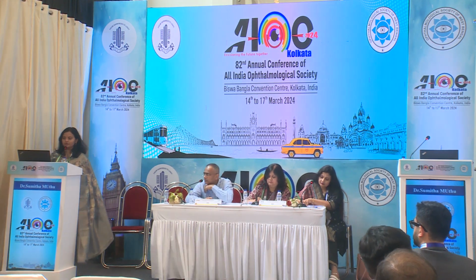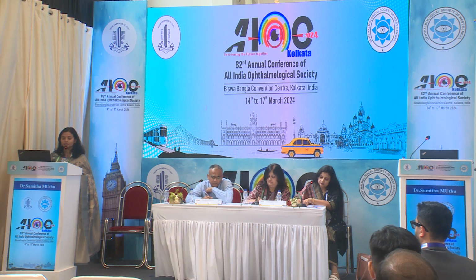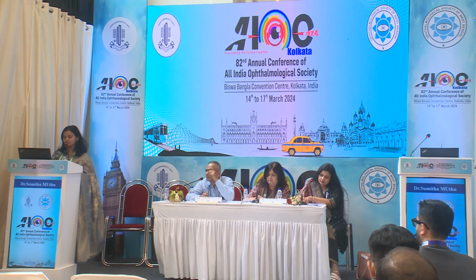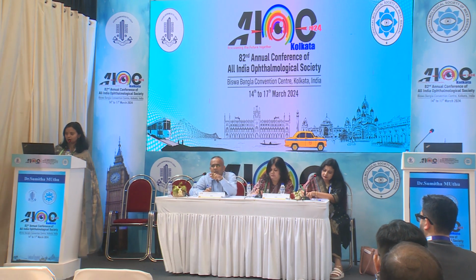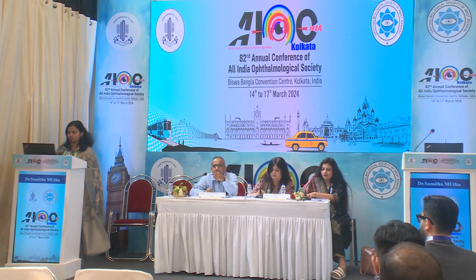A very good afternoon, everyone. I'm going to be presenting about how endo illuminator is used in pediatric cataract surgery as a guiding light, especially for beginners or novice surgeons in a dark tunnel as in pediatric cataract surgery. These are my co-authors and we have no financial disclosures to make.